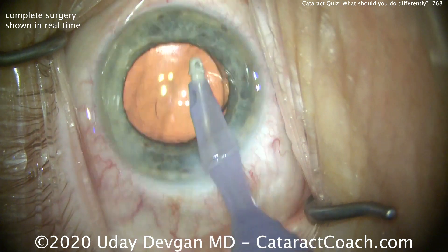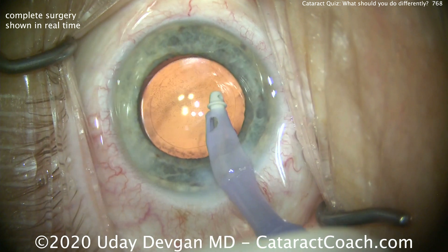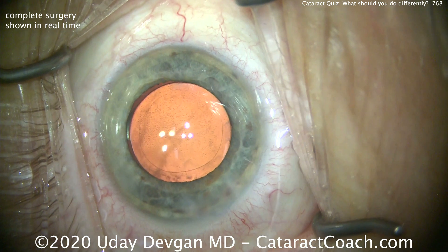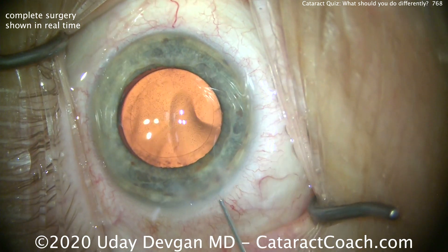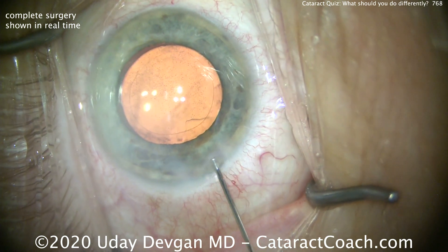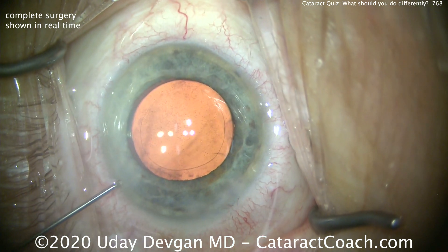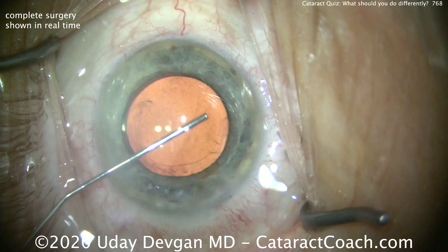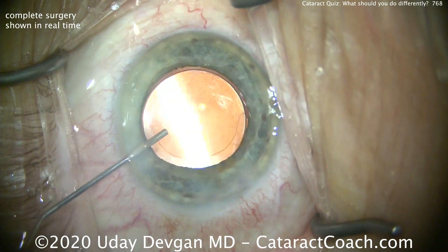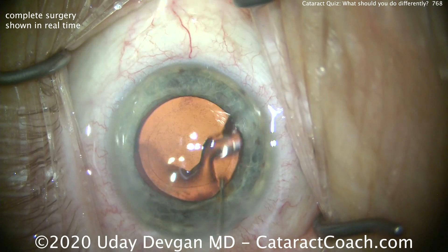At the end, we're removing the viscoelastic, being careful to stay away from the endothelium. The lens looks very well centered. Gentle hydration of the incision — don't over-inflate the eye. Keep pressure at a physiologic level of 20 mmHg or less. Finally, angle sweep: make sure there's no retained viscoelastic in the eye, as that'll also cause a pressure spike. Hopefully these pearls are helpful the next time you have a patient with Fuchs Dystrophy.